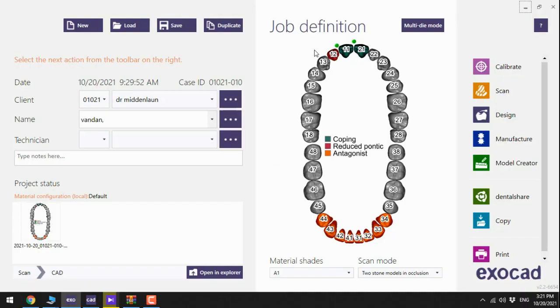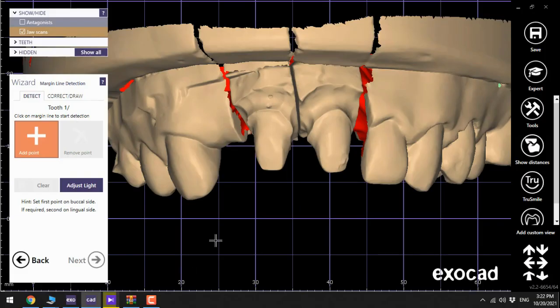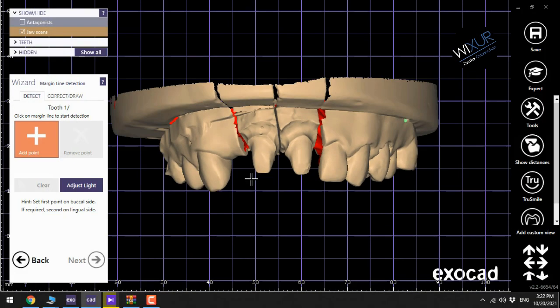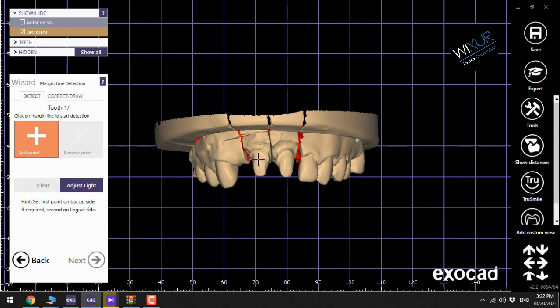I have already filled this data here so we can skip directly to the design. Let's start with the margin lines.